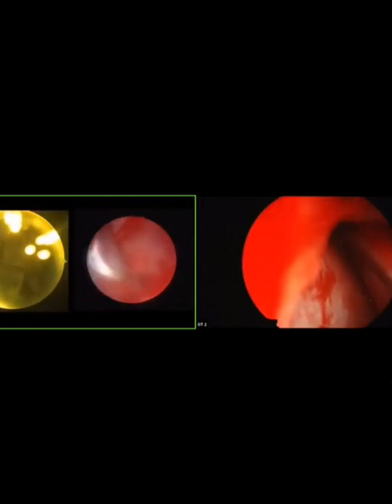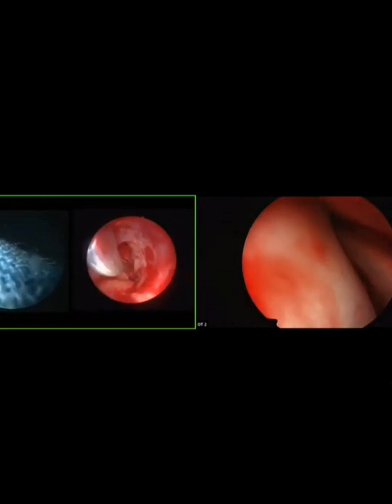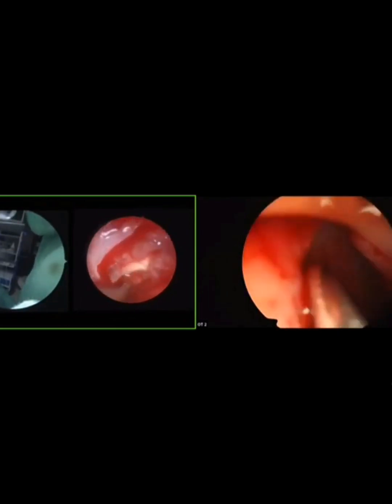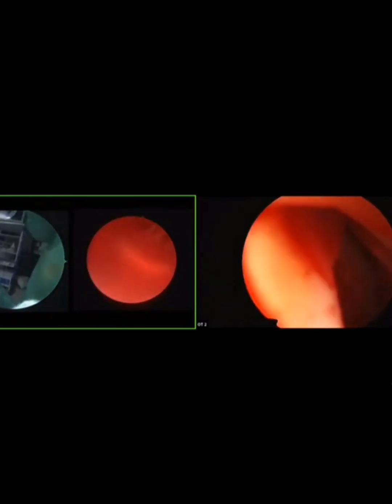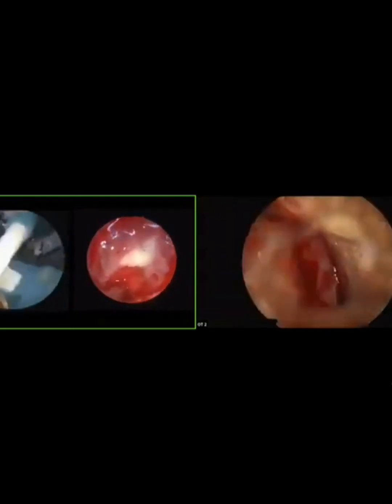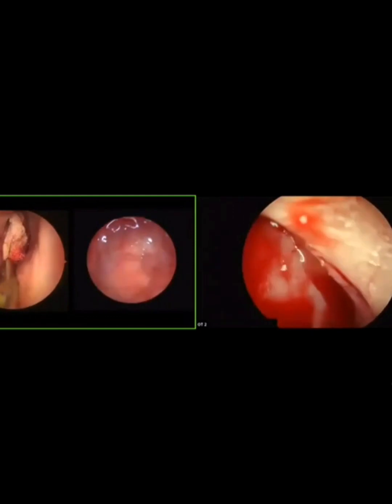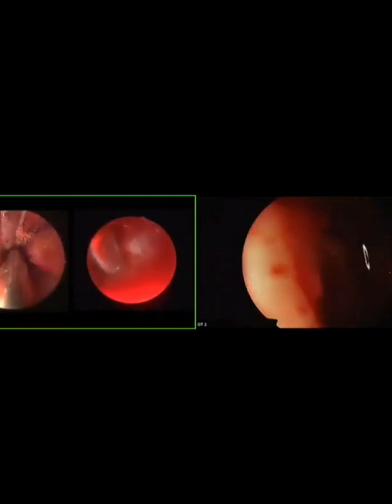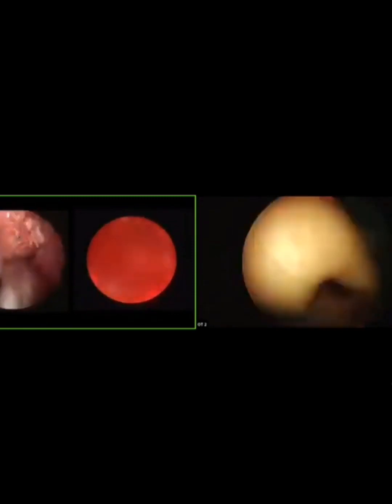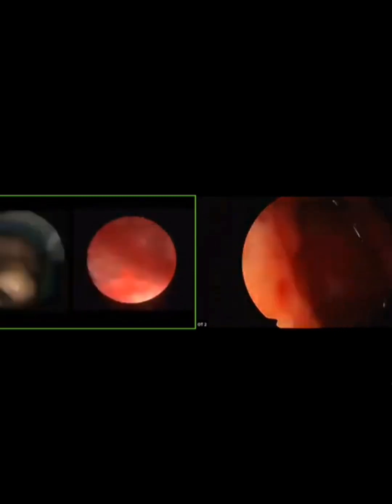Okay. Yes, see. This is the best way to remove the pus and anything from laterally. Okay. Because all edematous mucosa need not be removed. It will settle down post-operatively after medical treatment. So don't remove unnecessarily all the mucosa. Okay. See, pus is still coming out.